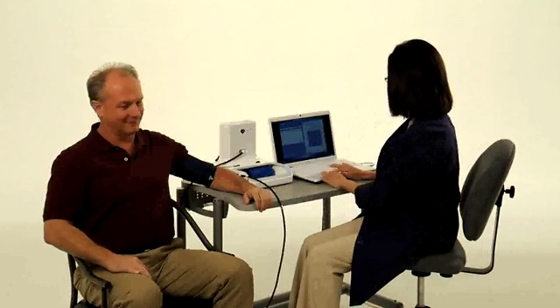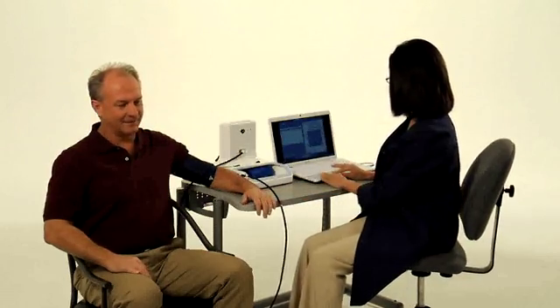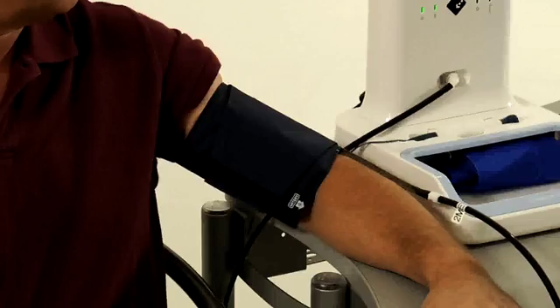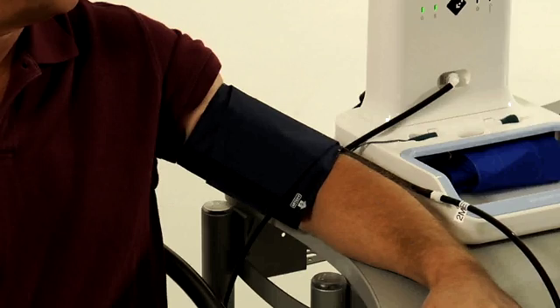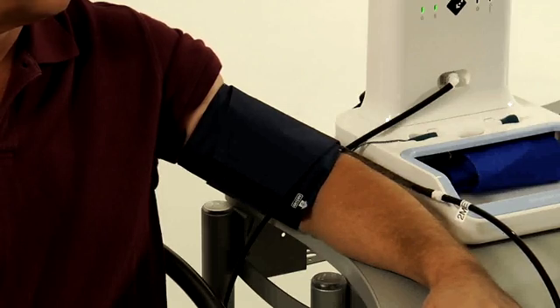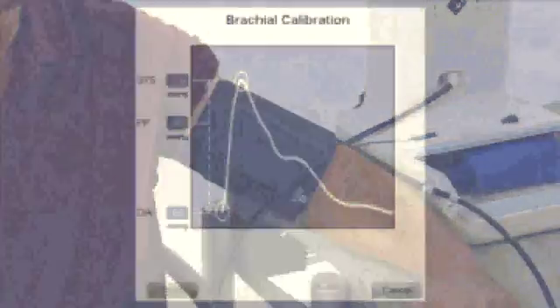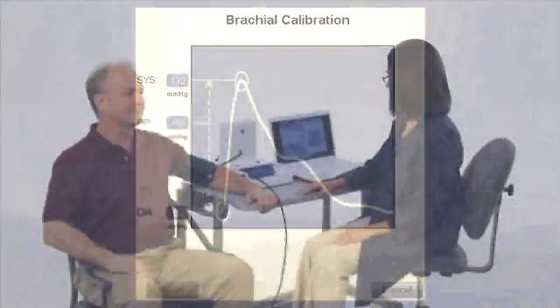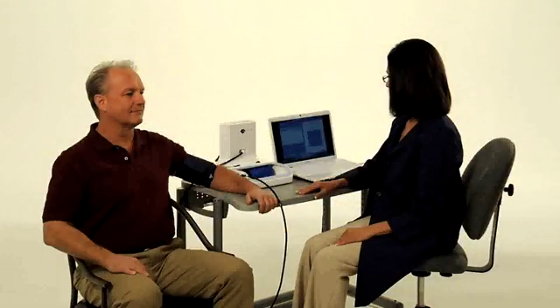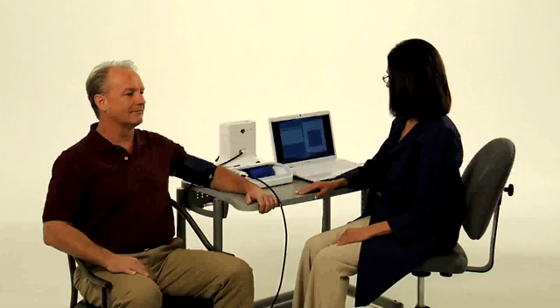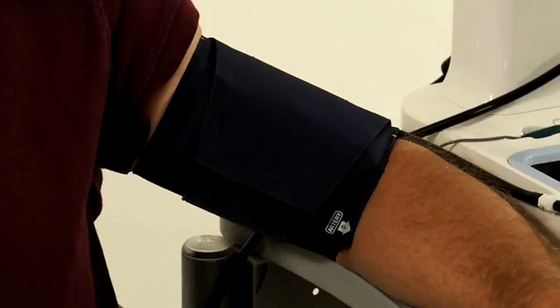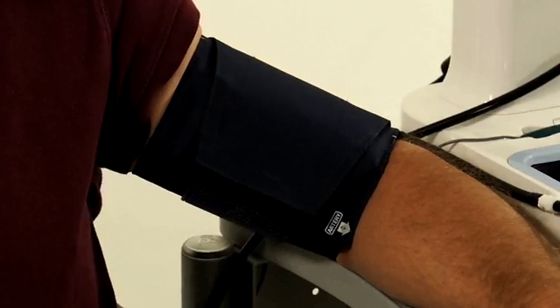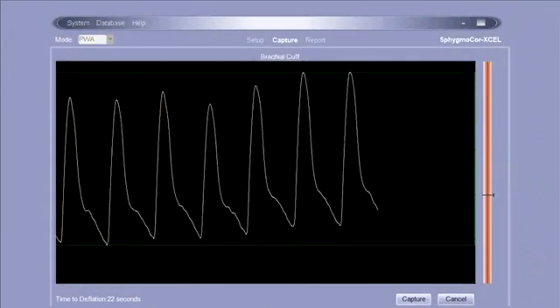Click start. The cuff will inflate and the SphygmaCor system will automatically measure brachial systolic and brachial diastolic pressures. The cuff will then deflate for five seconds before partially reinflating to capture the brachial waveform, which will be used to determine the central aortic blood pressure.